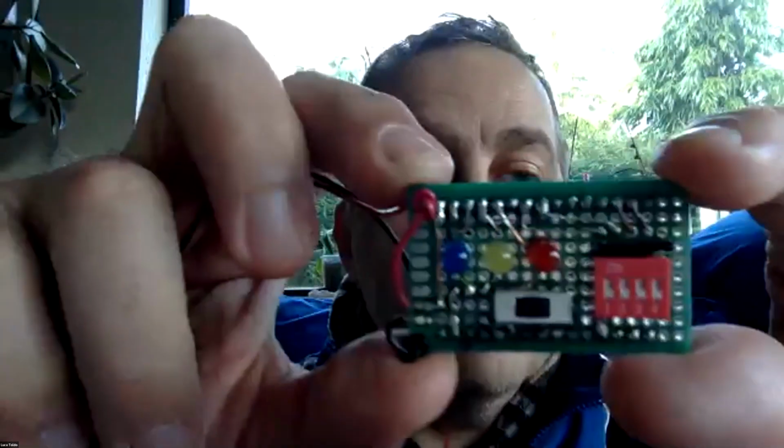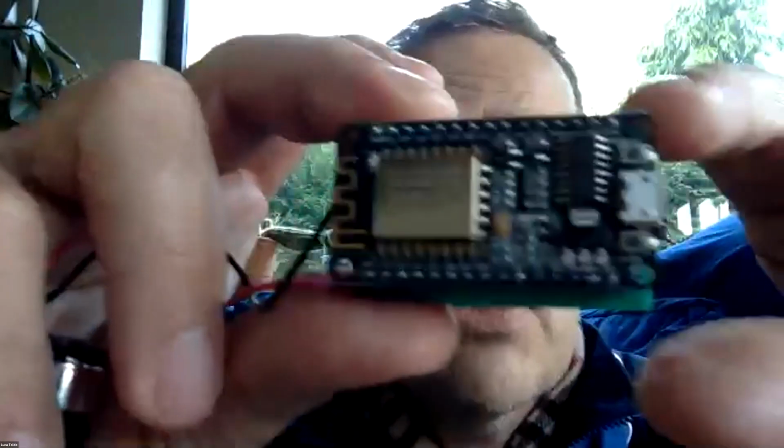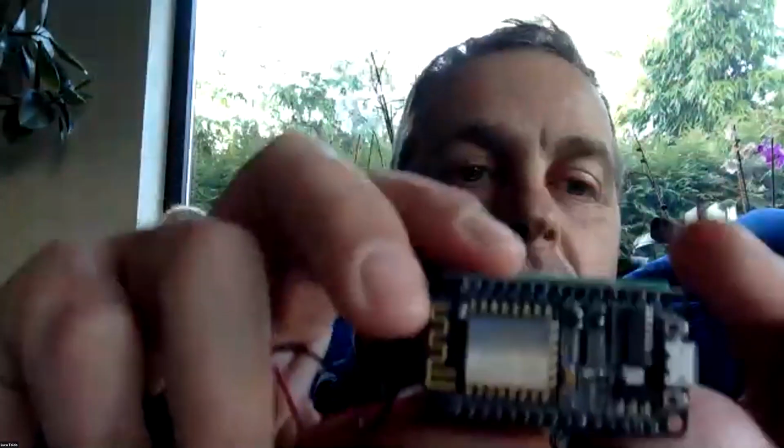device. Meanwhile, my son made an even smaller device, where the Node MCU is on the back. Also cool is that this device implements a cryptographic digital signature. Thanks to the Arduino software environment, which you kindly provided for free, this device digitally signs the message with RSA cryptography, which is then published on the public database for Fast Healthcare Interoperability Resources, and there nobody can tap it, because of the power of this small device attached to it and the easiness of programming, thanks to the Arduino.